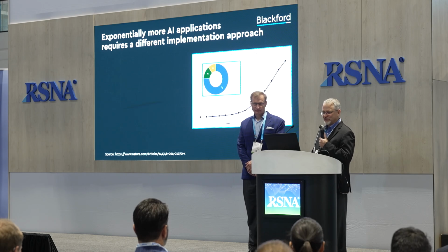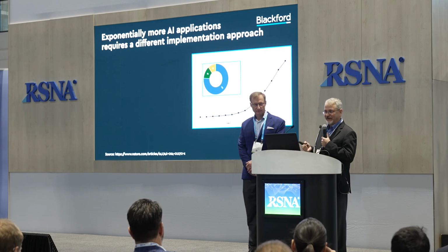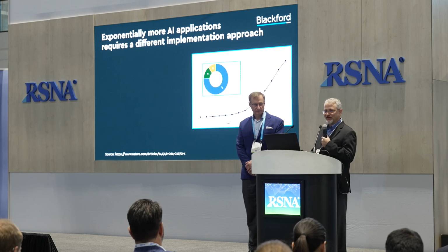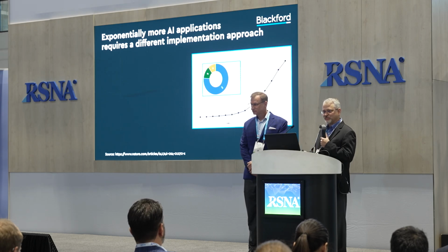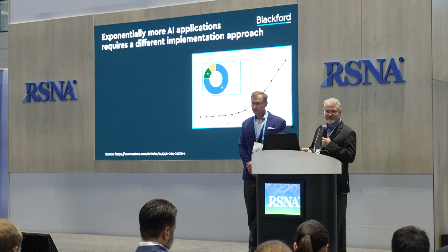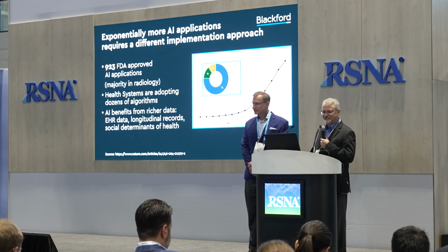I also think that there's an opportunity to enhance the way that AI performs today, right? We know that there's a tremendous amount of data in the DICOM data, but you can really enhance the way that AI is deployed in a health delivery organization if you add clinical data that's not based on the image itself. So we're starting to have this discussion around precision orchestration, where you can actually instantiate an AI model based upon not just a standardized body part and specialty mapping approach, but on a very highly specialized approach based upon patient history or patient age or ordering provider, et cetera. So we know there are significant benefits to adding clinical data to AI. And so the question is, how do you start to do that sort of thing?